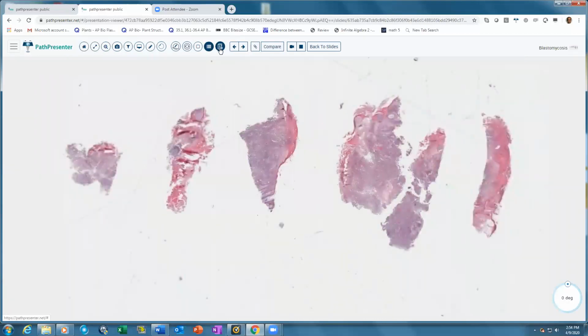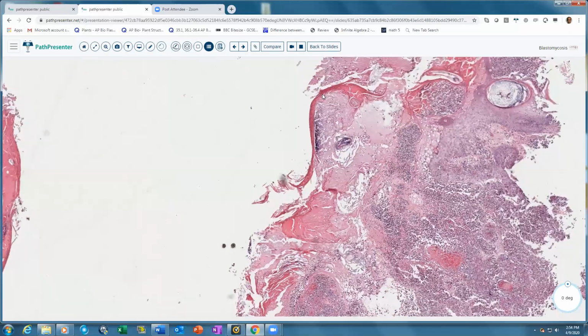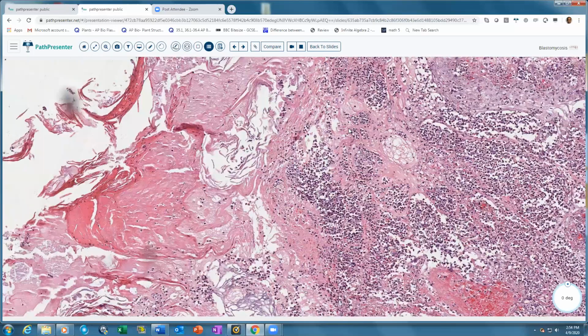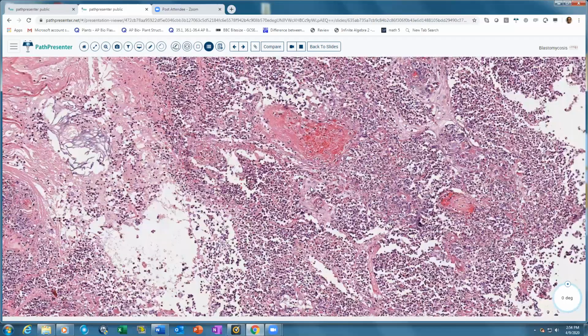So when you look at the histology here, again, we have the background of the granulomatous and suppurative inflammation. This is also associated with some pseudoepitheliomatous hyperplasia. Many of the deep fungal infections are going to show you this pseudoepitheliomatous hyperplasia on the top, and then the suppurative and granulomatous inflammation. So again, you should immediately think of fungal infections or atypical mycobacteria.